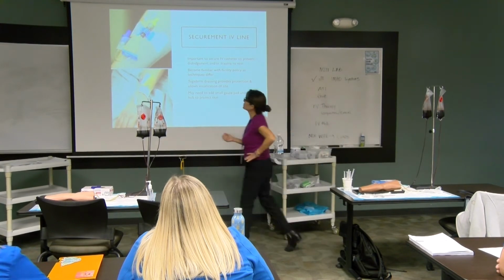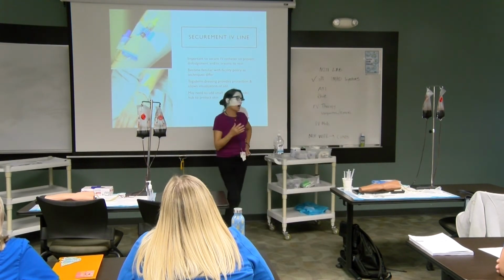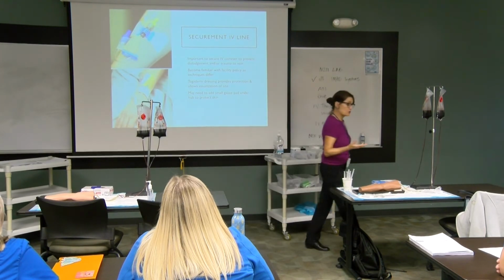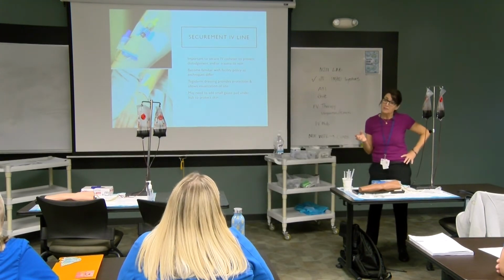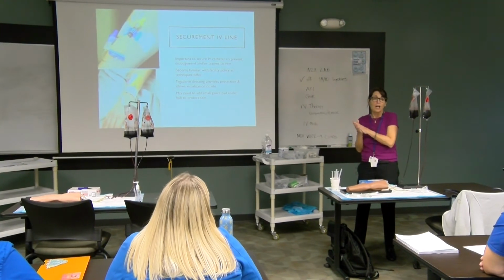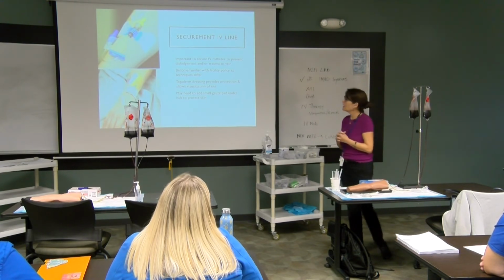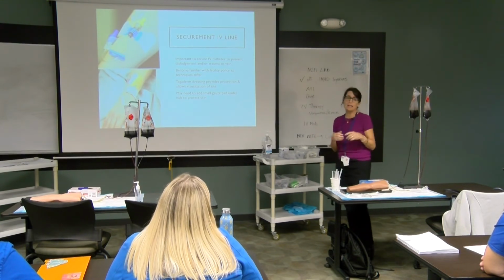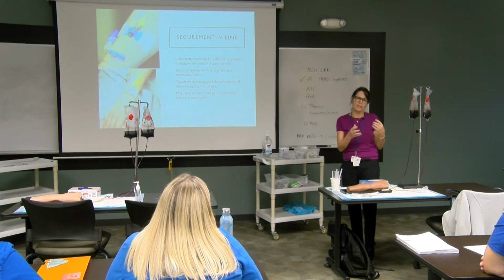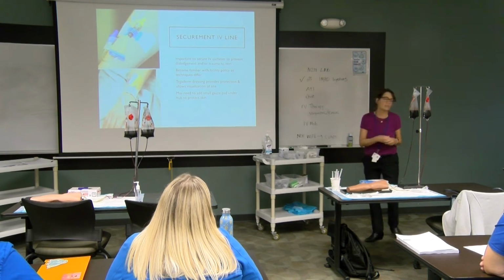Some places where you work may just stabilize it with a Tegaderm and tape. There is research that shows that stat locks may help the IV last longer, so ultimately it might be less expensive, but you know how that goes. Stabilizing it is important, and it varies depending on where you work whether or not they use stat locks. But good question.